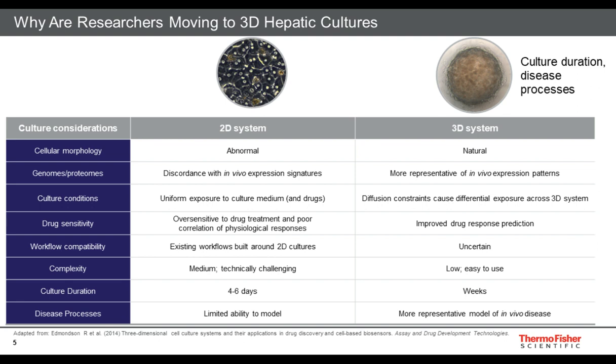A paper I will reference a little bit later also indicates that the predictivity, certainly with respect to hepatotoxicity, is vastly improved in the 3D cultures versus traditional 2D from the same source. So a number of really key benefits in using this type of 3D culture system.